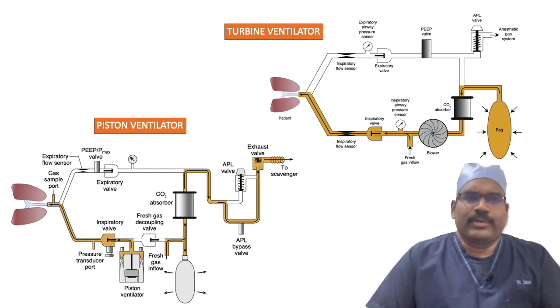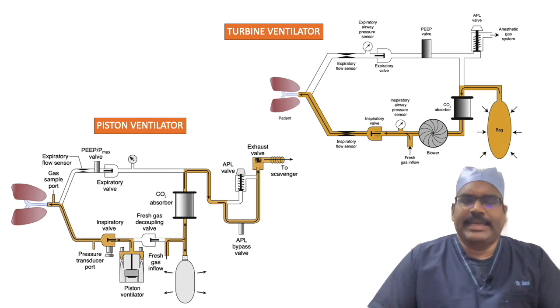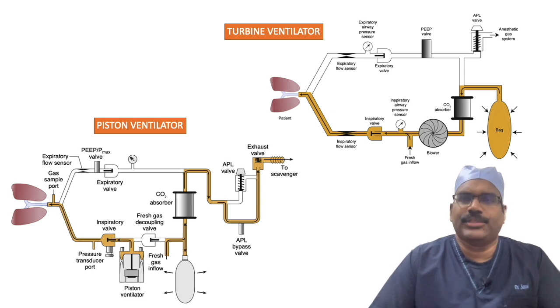Hope you have noticed that unlike piston ventilators, turbine ventilator design implies that the breathing bag empties during inspiration and refills during exhalation. There is no decoupling valve in this type of ventilators. The bag's motions may serve as a visual indicator of ventilation and, depending on set fresh gas flow, of circuit leak also.